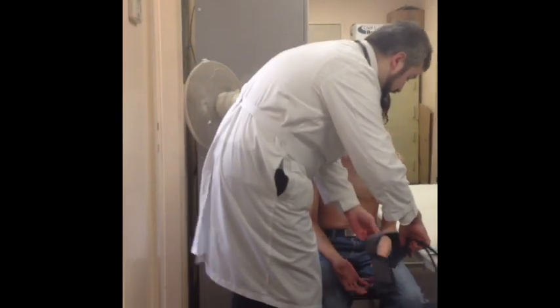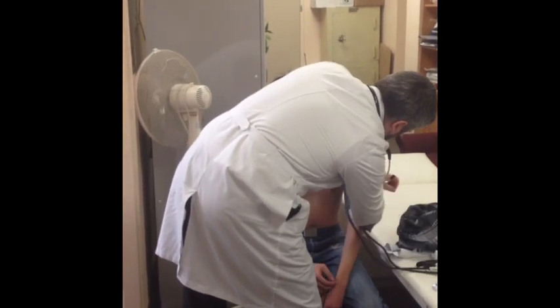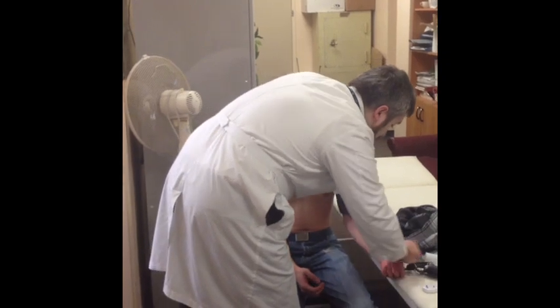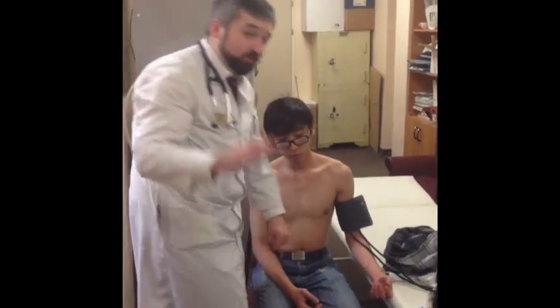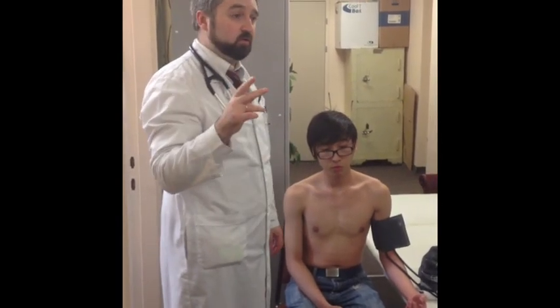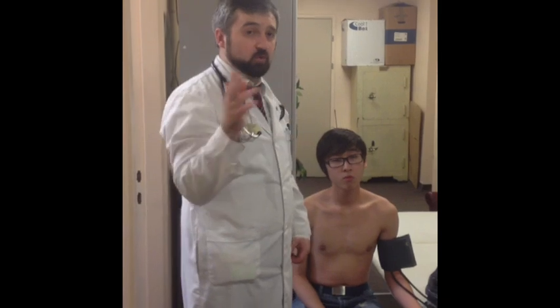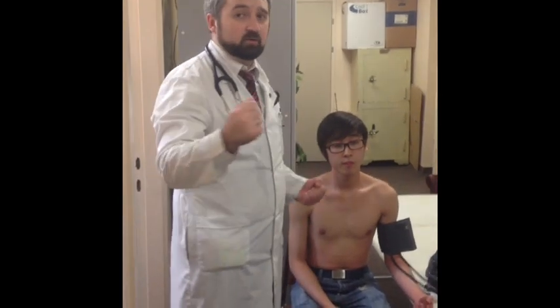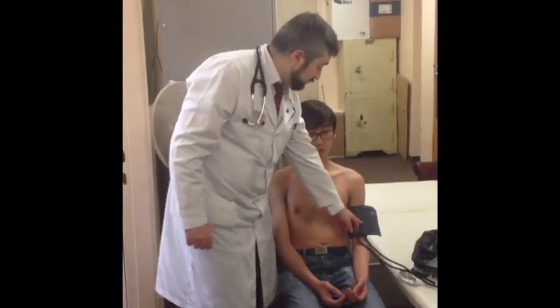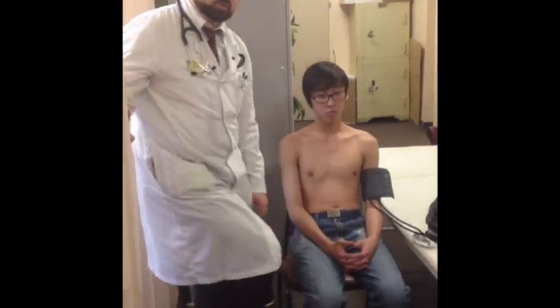Once you apply the cuff, the patient must be in a resting position for at least five minutes before the measurement — no jumping, no smoking, no watching TV. No coffee 30 minutes before, no smoking 30 minutes before, no alcohol, no long-distance running. The patient should be relaxed. The arm must be at the level of the heart, and the legs should not be crossed.